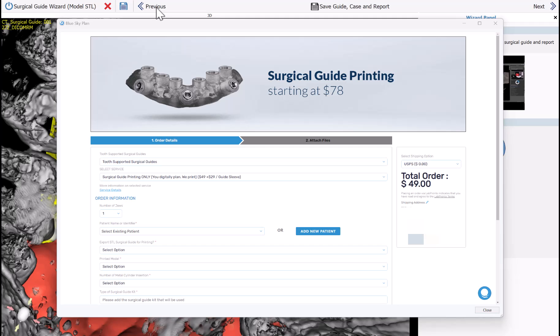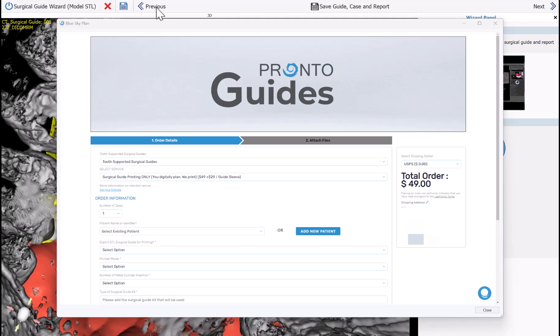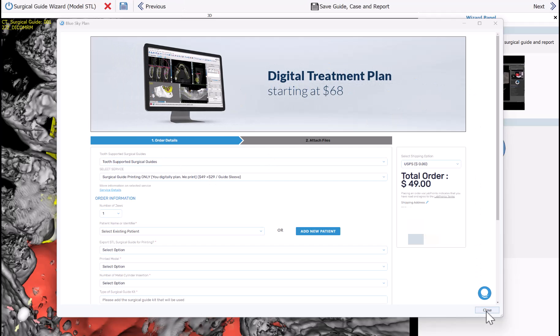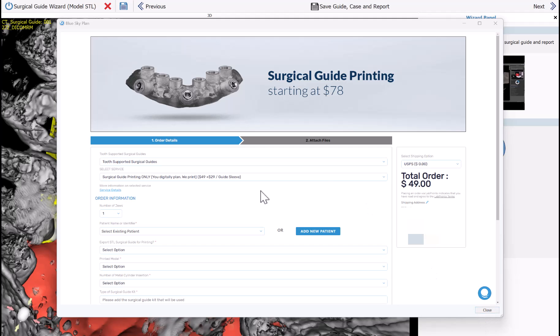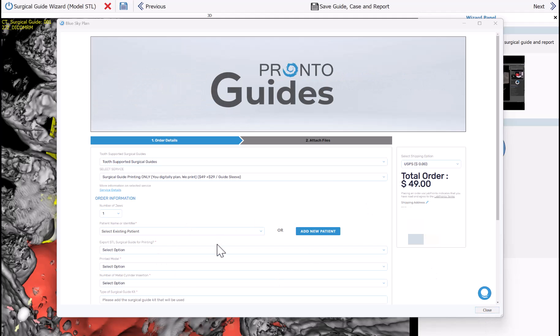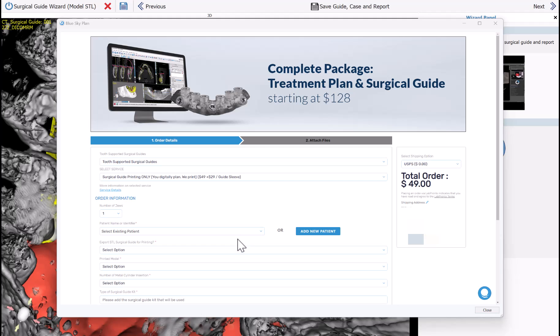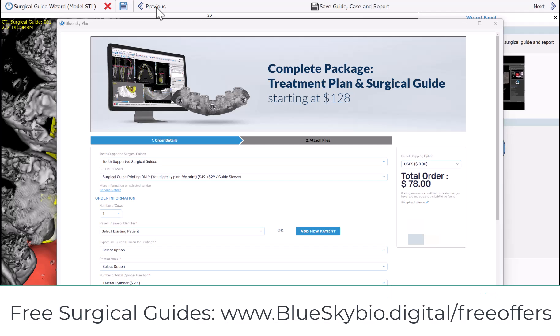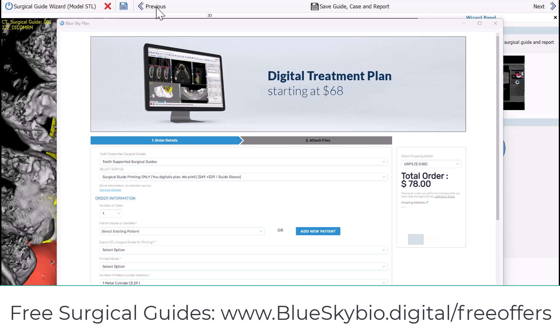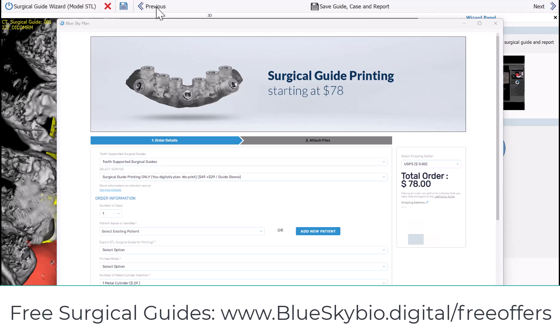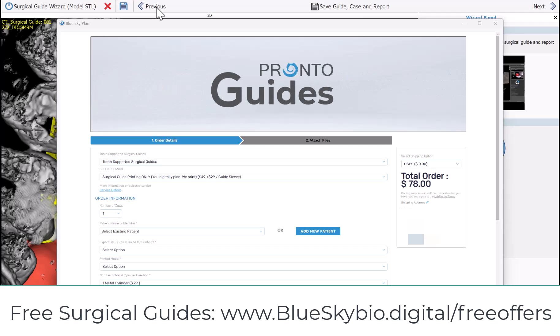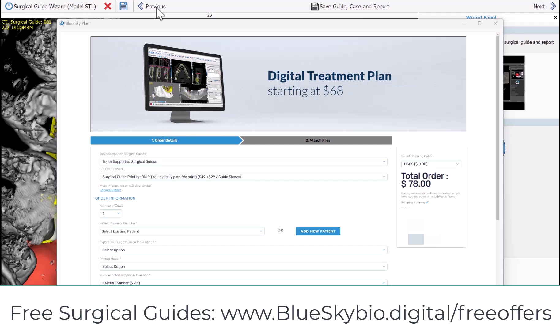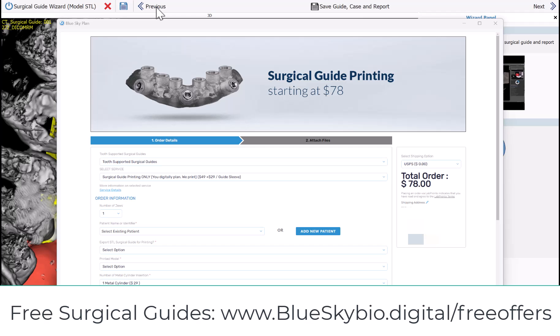An order form now appears on your screen. If you're going to manufacture the surgical guide in-house, simply click Close. If you'd like to outsource the manufacturing, complete the order form — the data will be attached automatically. Blue Sky Bio actually offers free surgical guides, including the digital design and manufacturing, for Blue Sky Bio customers on single implant cases. You can see more information at blueskybio.digital/free-offers.